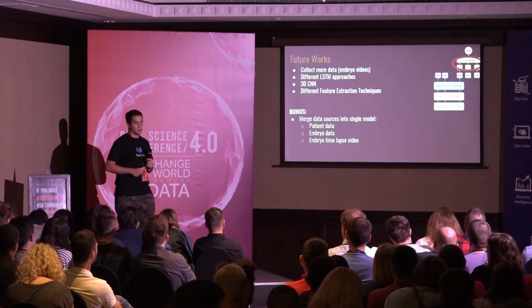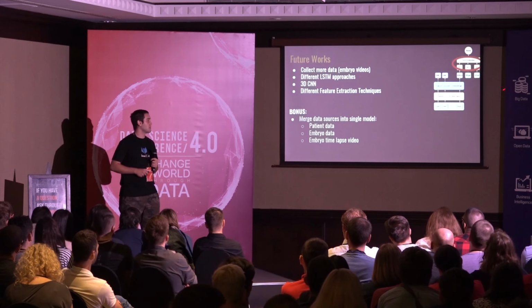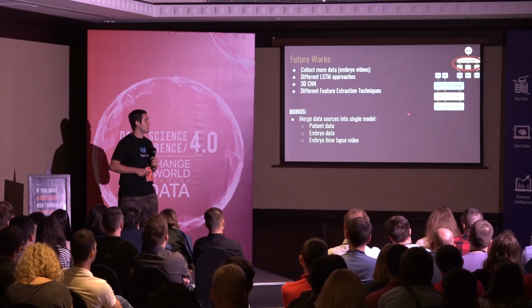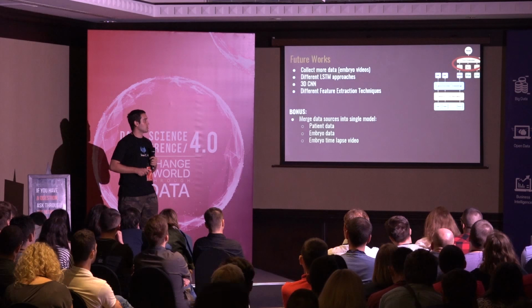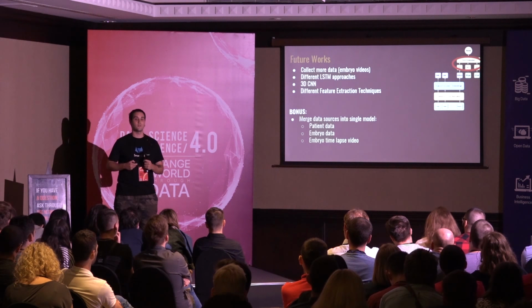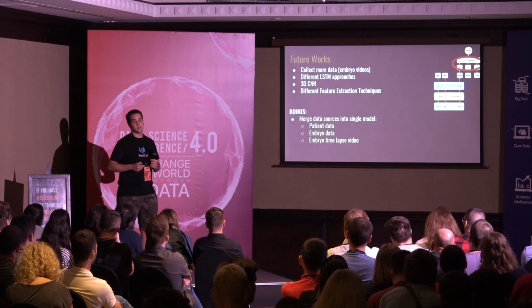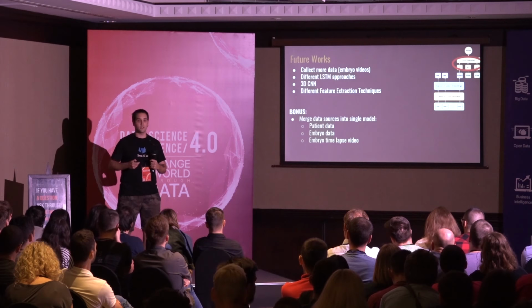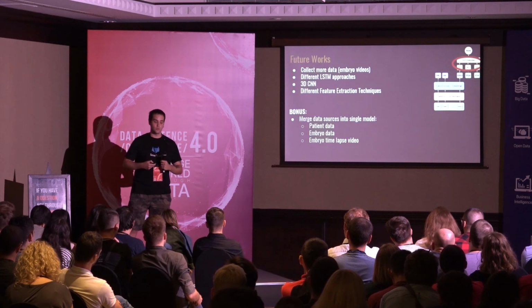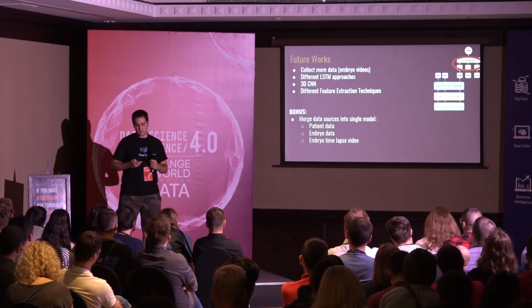And as a bonus, the most interesting part is to make one end-to-end solution which will take the embryo video, process it, and then take additional information about that video, for example some patient records and some handcrafted embryo features, to let the neural network look at all this and make the best decision.